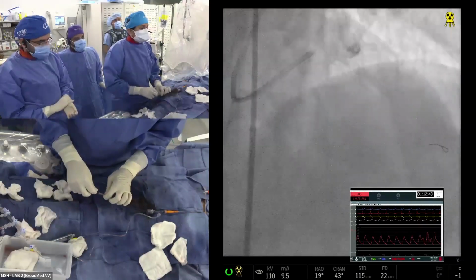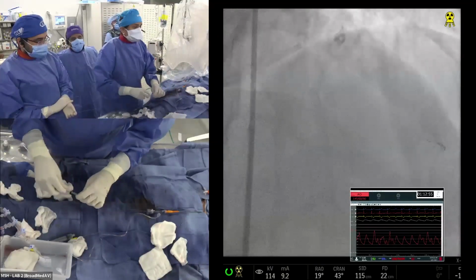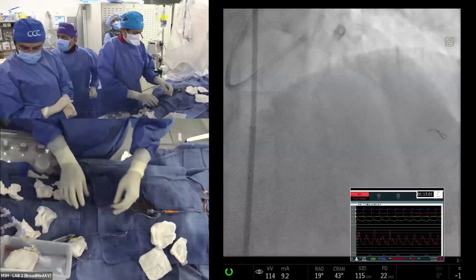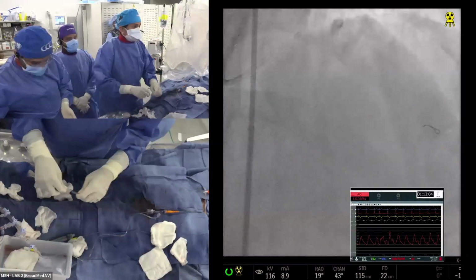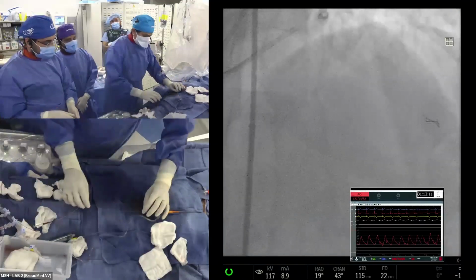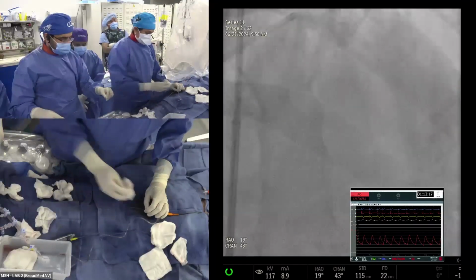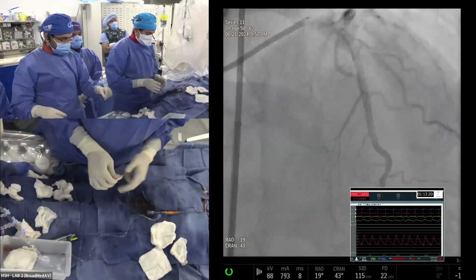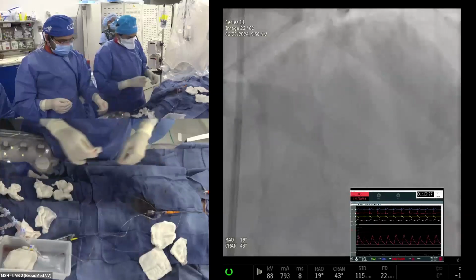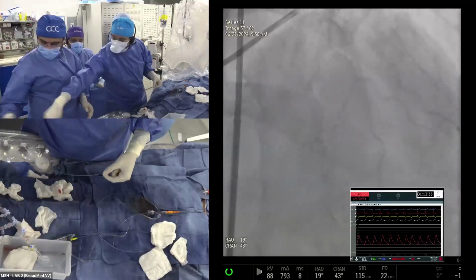So the question, maybe we can ask the panelists and our audience, is whether they would do a two-stent approach, or a stent or drug-coated balloon in the diagonal. I think that is a good question, and Paul may have a different opinion. But let's show the picture once again so everybody has that in mind. Dr. Sharma, what is the size of the stent in the diagonal that was put earlier? Yeah, it was 2.75 in the diagonal and a 3.5 in the LAD in 2011.